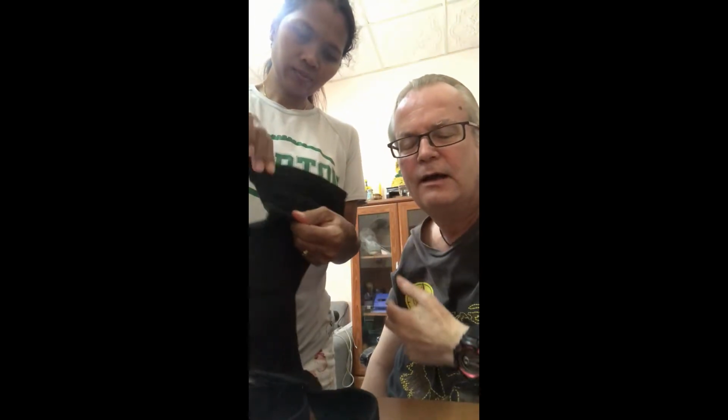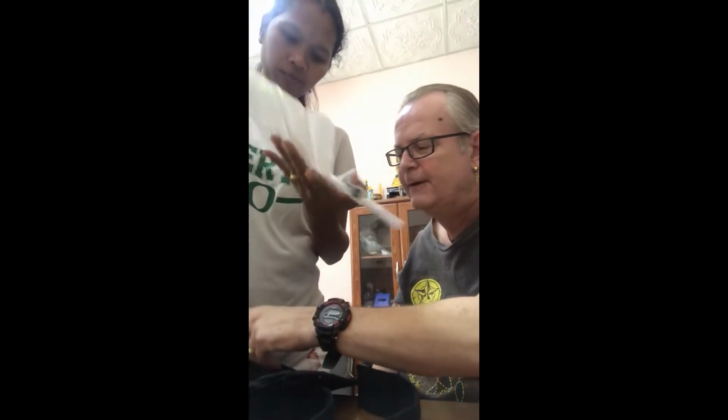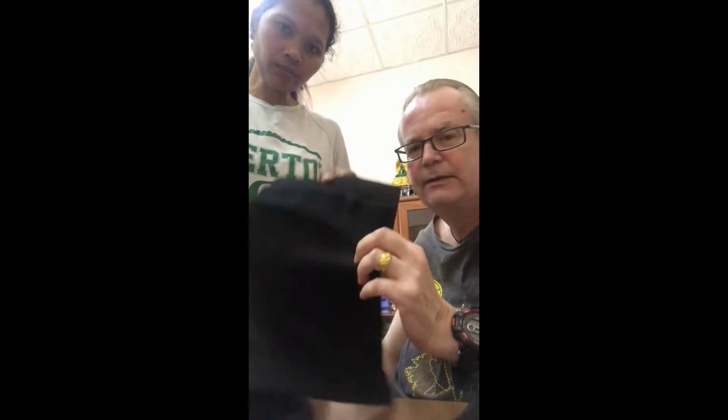So if May closes it again, you've got some material to hold on to when you want to open it again. So it's not difficult. Even I can do it, and I can't use my right arm really, so I can lean against it and pull it with my left hand. Just to show you, you can see there, 2,000 milliliters. This is a standard bag, so that can go in nice and very swiftly into the top of the TP bag cover.